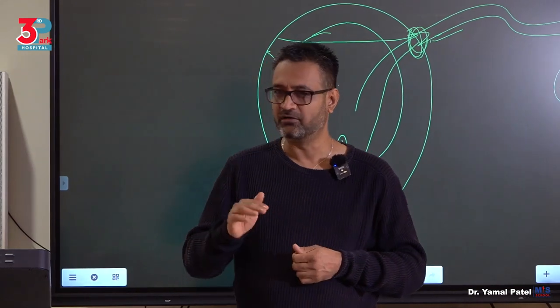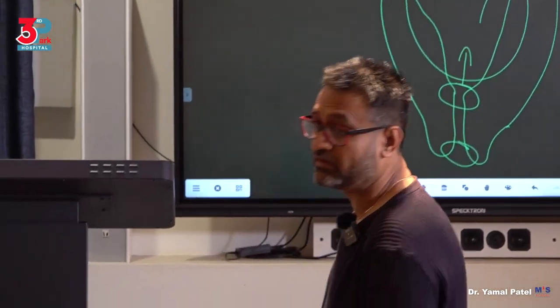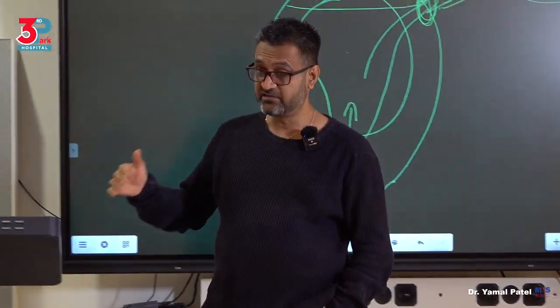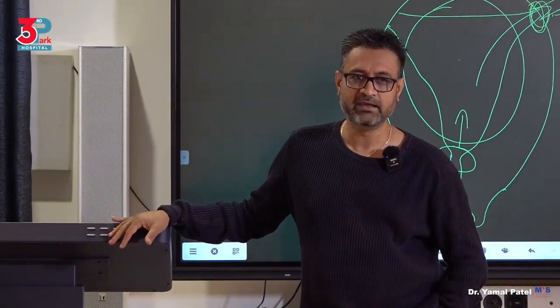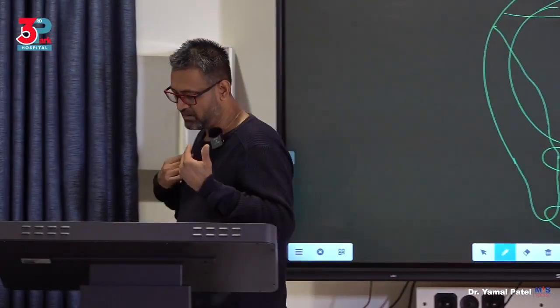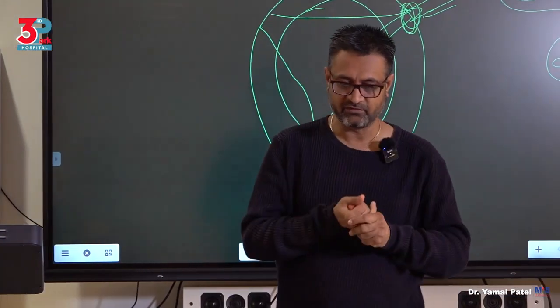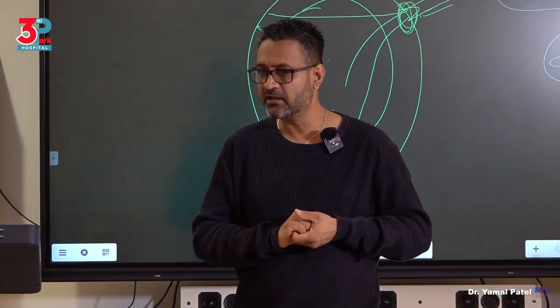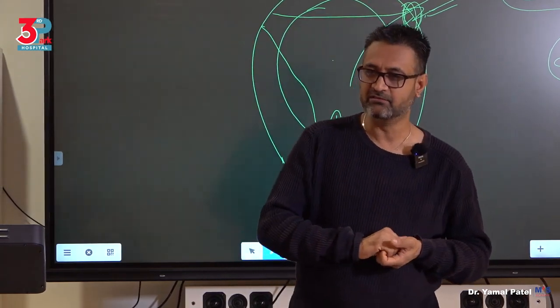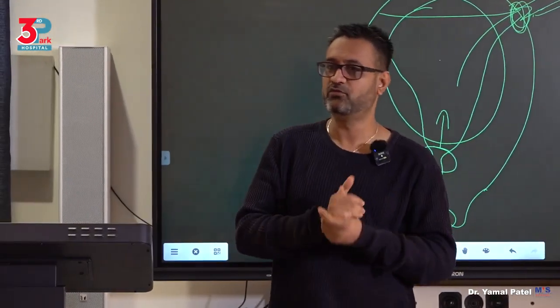So you should know your cutoffs. So number one, know your pressure settings that I've told you. The flow rate can be set at 200 to 400. So flow rate 200 to 400, pressures at or below 100, play around the MAP, okay? Number three, when you're talking of the volume of fluid used, that's the third important parameter. So for volume of fluid used, for example, for saline, which is isotonic, you are interested not in the volume of fluid used, but you're interested in the deficit of volume of fluid.